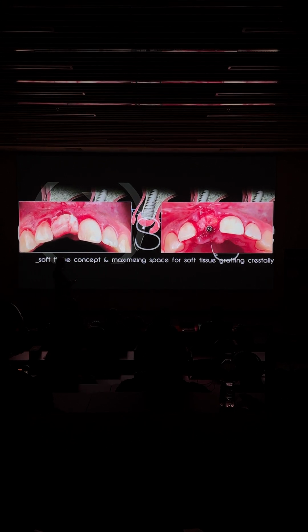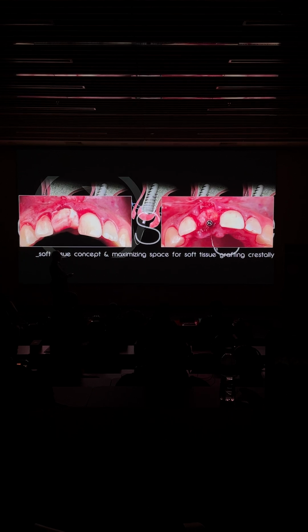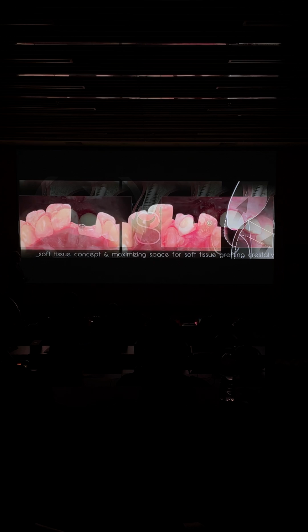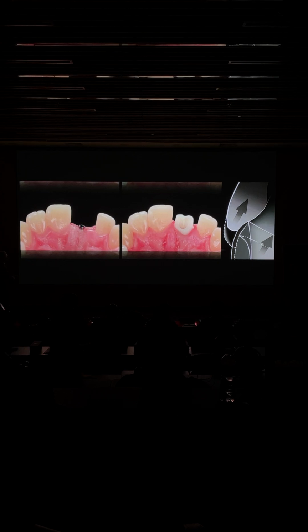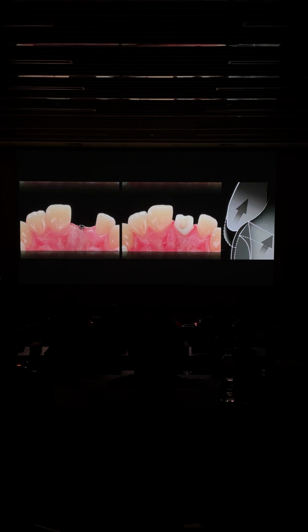The more you place your incision on the center, and the more tissue you put at the back, the more difficult it will be to suture it crestally. Okay? So then you can go from this healing abutment to an intermediate healing abutment. You can use a wider healing abutment, you can make a custom healing abutment, or you can jump directly to a final zirconia abutment.